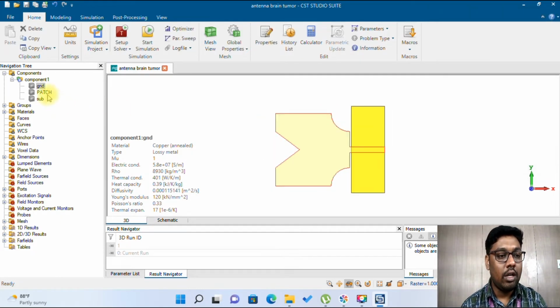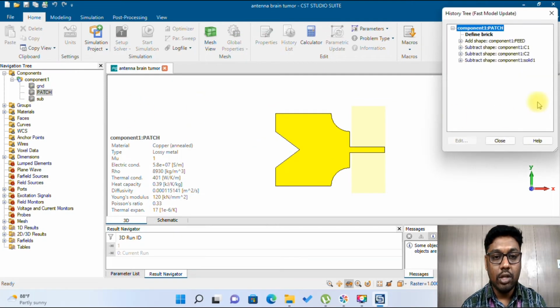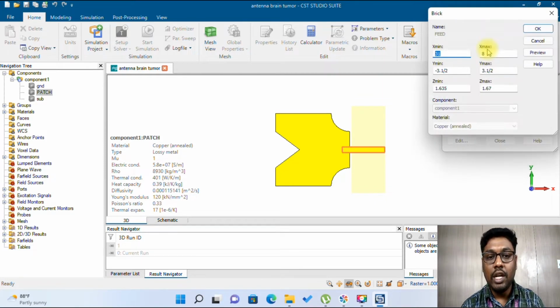Coming back to the top layer, that is your patch, which is again made of copper with a thickness of around 0.035 mm. I designed a square patch, which you can see highlighted here. After that I attached the feed, where the signal input is given to the microstrip. I calculated the width of the feed using the inbuilt calculator, which matches your 50 ohm impedance, and I designed it accordingly.